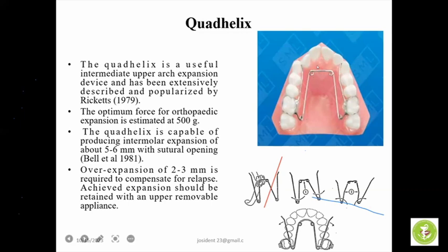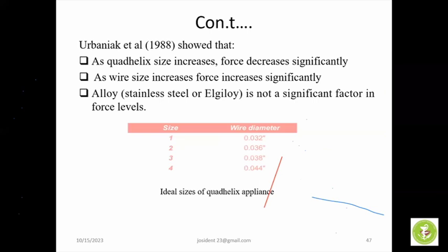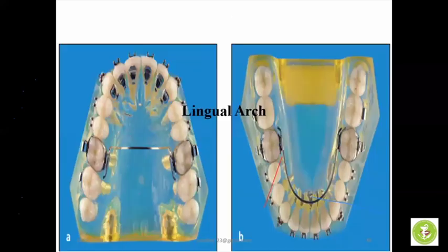You have point one activation in the anterior segment. When you compress using 3-prong pliers in this segment, you could have expansion of the sides, so it will bring about some transverse expansion. When you make activation at point 2, you could receive some expansion in the premolar and canine region. So this is how we expand transversely in young patients, and also to bring about some buccal tipping. Most of the effects are dental. So these are the different uses for the quad helix.